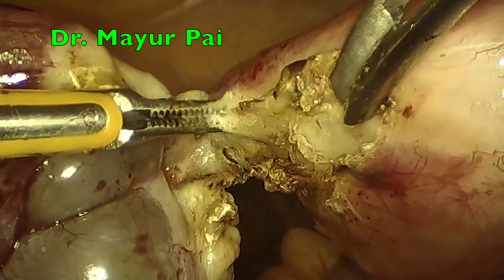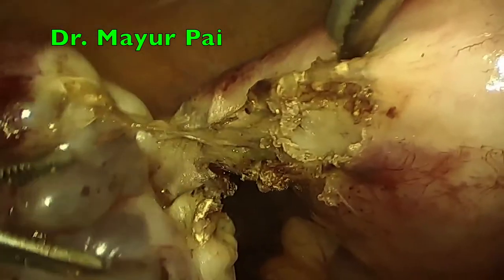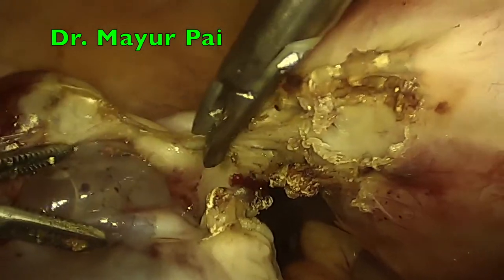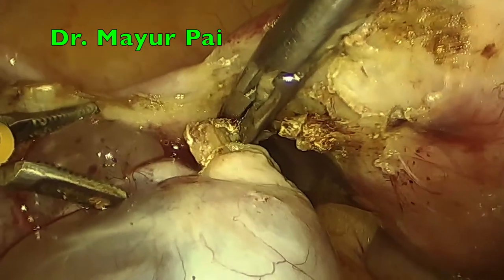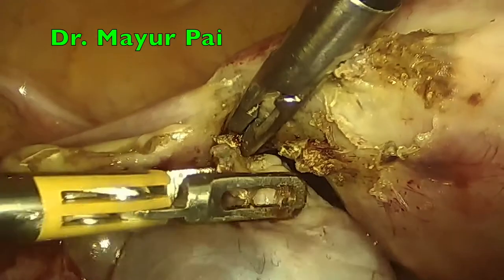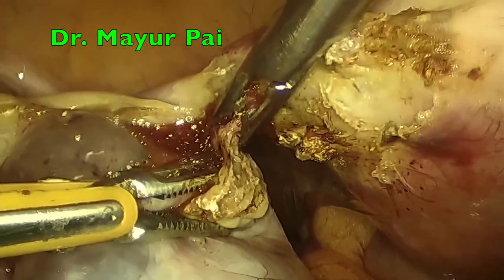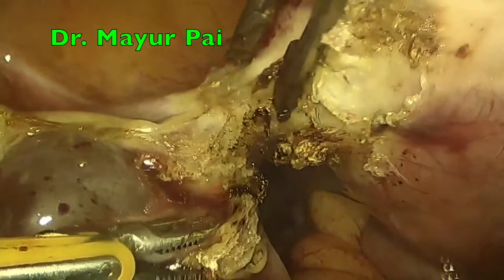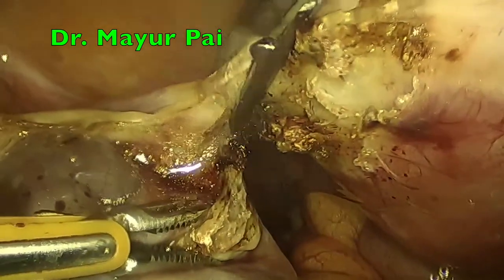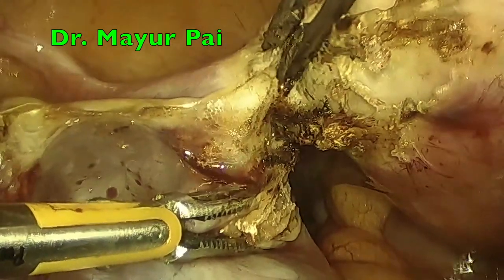Now we are finishing with the deeper part of the fallopian tube. Mostly a vein is found in this area and it's notorious for causing some bleeding. Since both the instruments have the ability to coagulate, it comes in very handy. Now we are coagulating the left-sided round ligament.